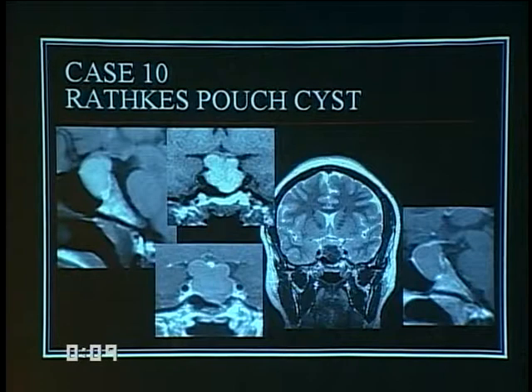effects of this tumor. Rathke's cleft pouch, part of that big, long SATCHMO differential that those of you that are preparing for the board examination are going to rattle off probably even faster than I can. Just a good example, it sort of looks like a pituitary macroadenoma, which is why it fits into that differential so well.